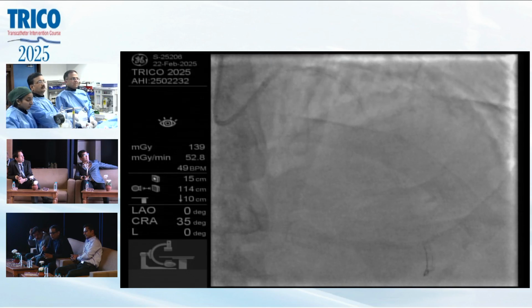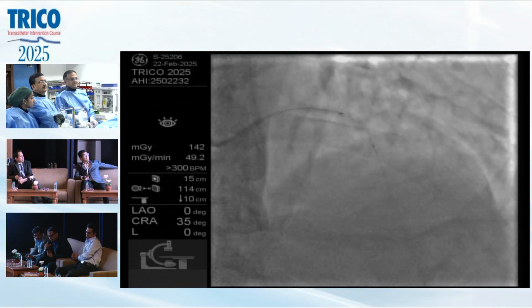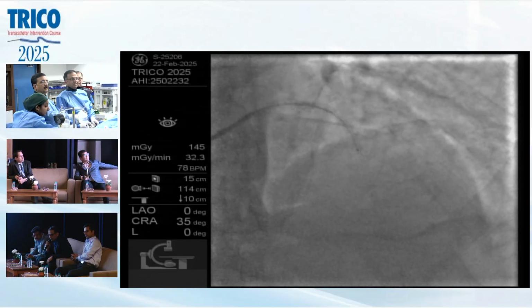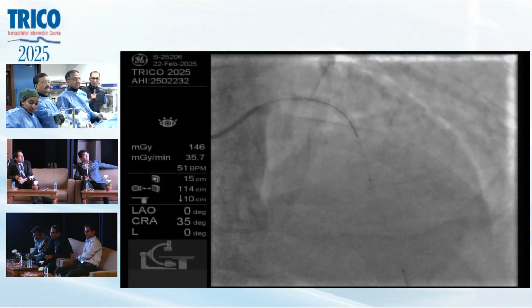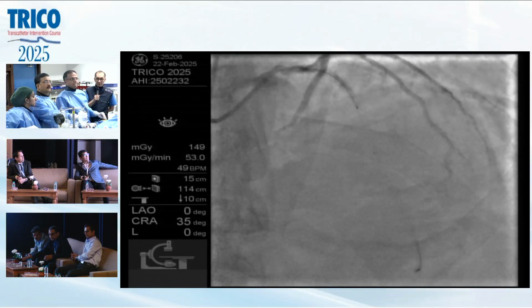Doing the OCT, I think that there's a special technique you're going to show us. Yes. Let me just go a little further. Engage. Guide. Can actually inject into the central lumen. Right. So can you tell us what you're doing?